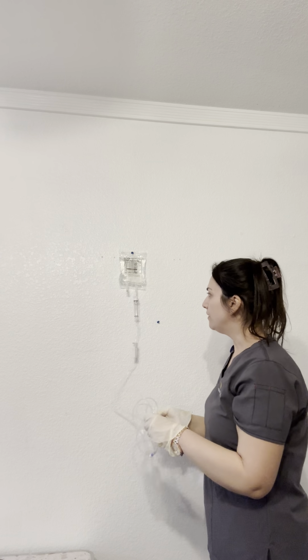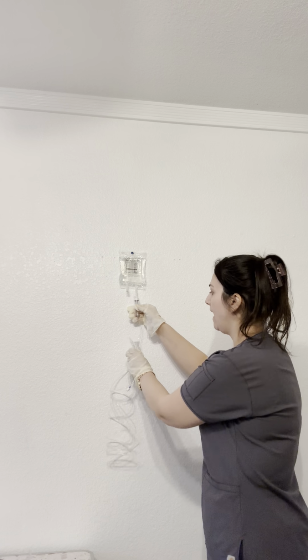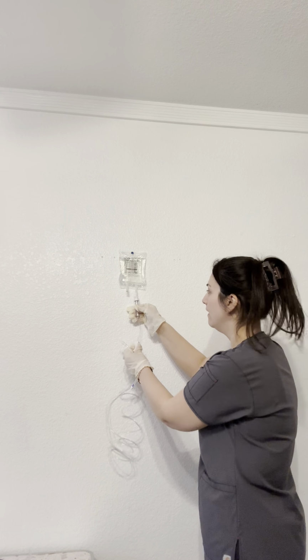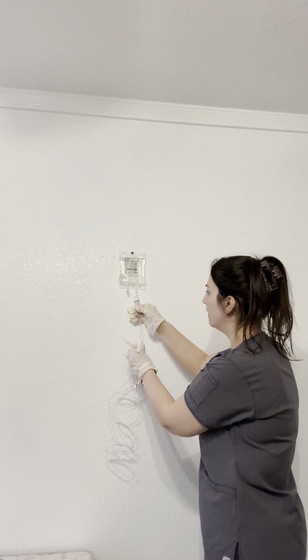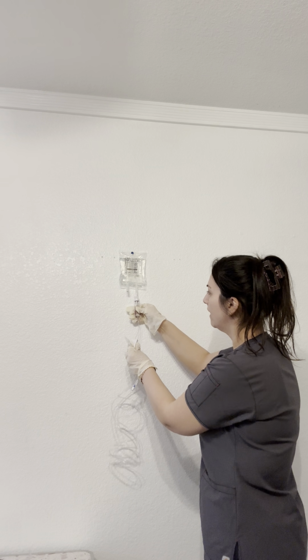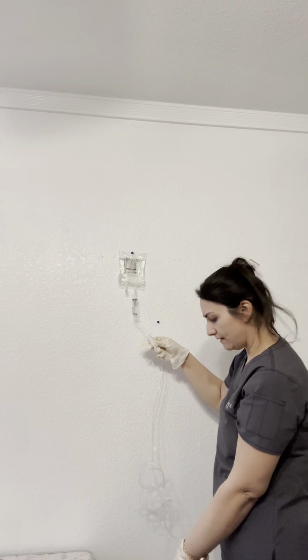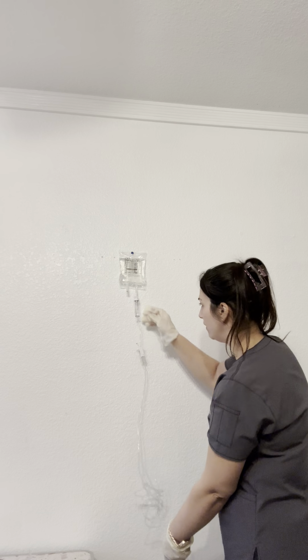Next, we're going to make sure that we fill this up halfway. We're going to prime it, so we're going to make sure that the fluid goes in there.